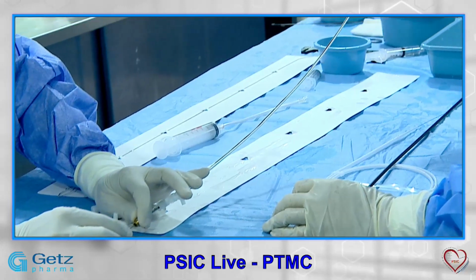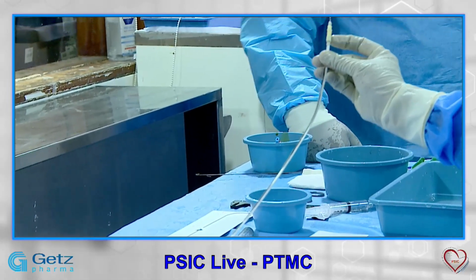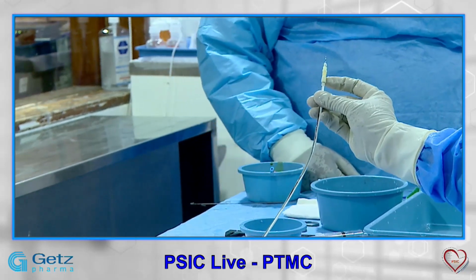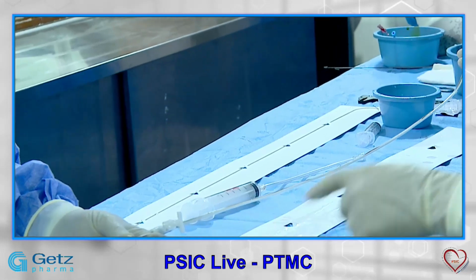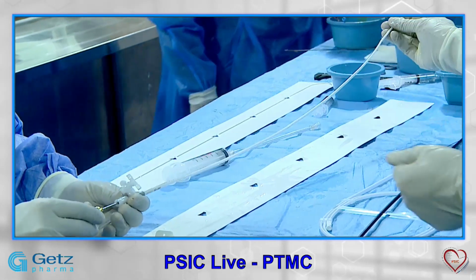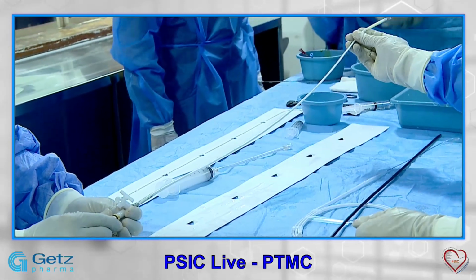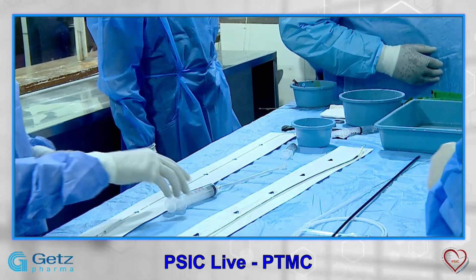If you pull it out through the septum in this position, it may cause a kind of septostomy. So that's why, when you are crossing the septum, the balloon should be stretched. And when you are bringing it back after completing the procedure, the balloon should be in a stretch position. So these are the parts of the balloon.